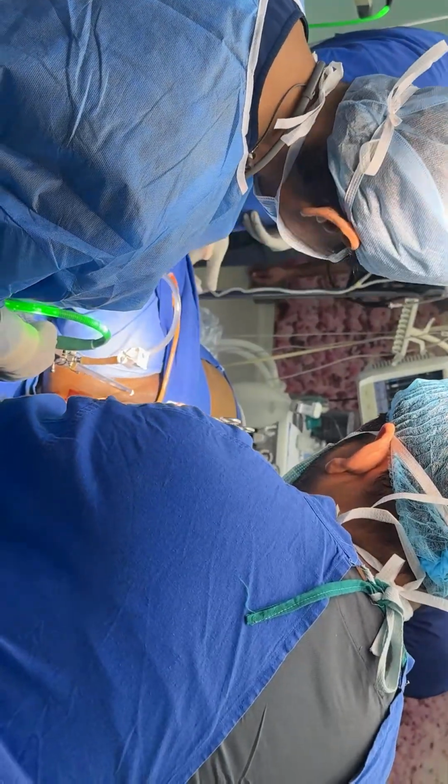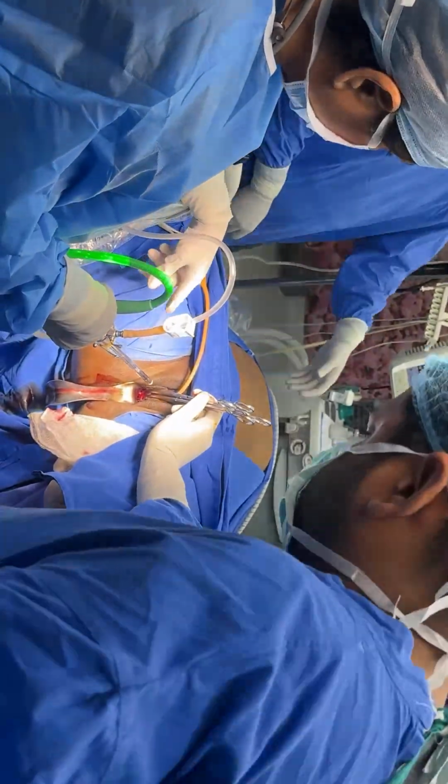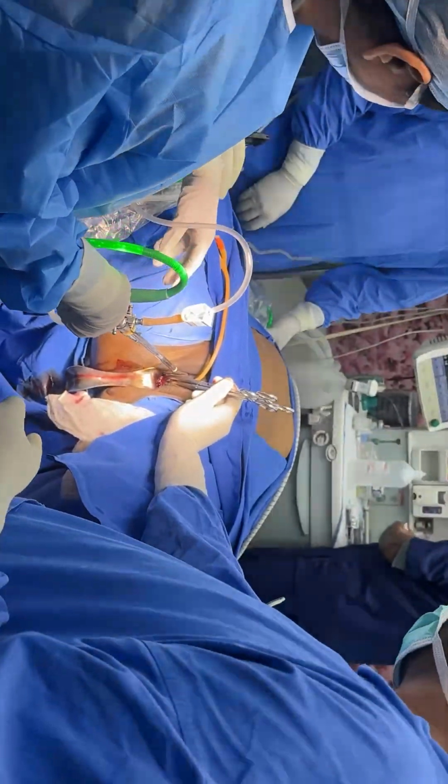And now the fluid. So yeah, the first we start the fluid, we make a thorough check that there are no bubbles. Slow down.